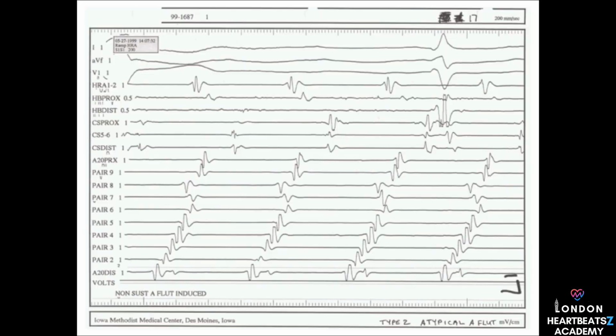This one's showing uncommon atrial flutter. It's got clockwise atrial activation, so it's still atrial flutter, but the signal's going in the opposite direction. The atria are doing the wave in reverse. Exactly. Figure 18, this one shows atypical atrial flutter.